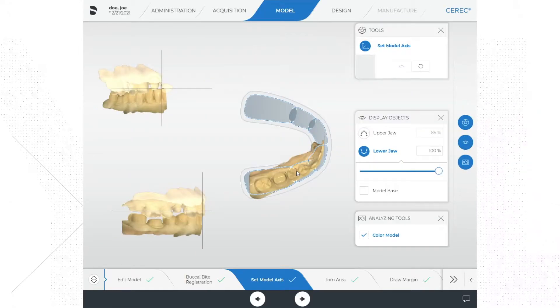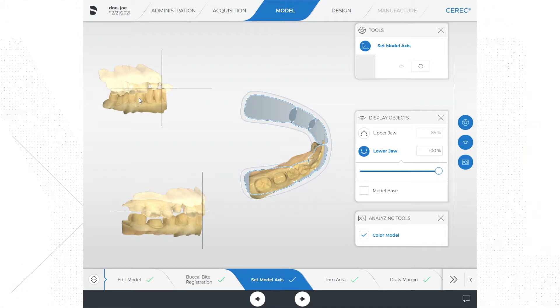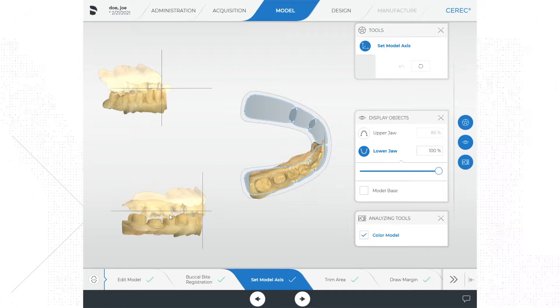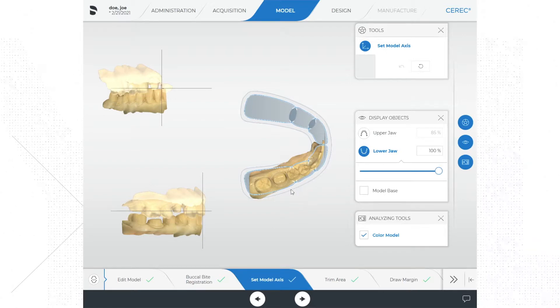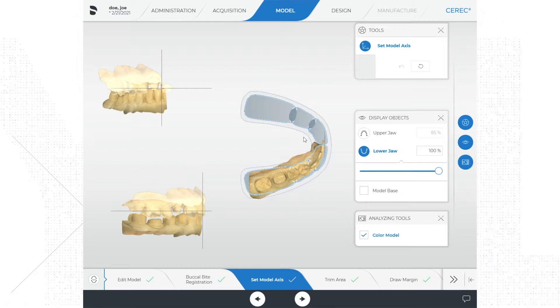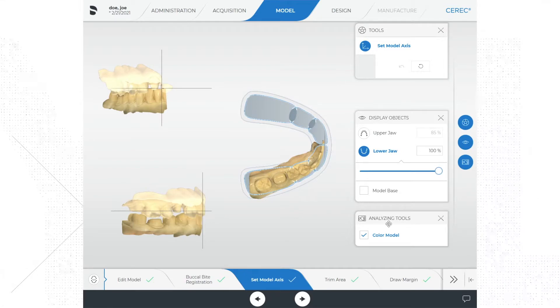In the upper left portion of the screen is a box that contains a frontal view of the model. In the lower left portion of the screen is a box that contains a side view of the model, and in the center of the screen is the overhead view of the model. To the right of the screen you will see options for a tools menu, display objects menu, and analyzing tools menu.